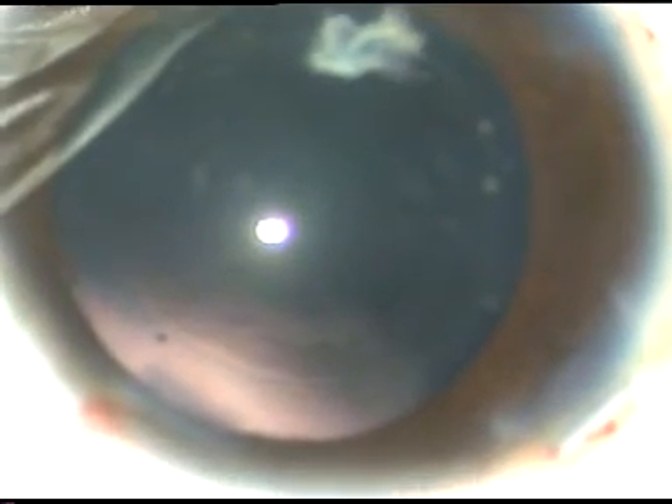A nice flap has been made. Now I hold this flap with Utrata forceps, go anti-clockwise, include this fibrous plaque, and a nice posterior capsulorrhexis has been made. I don't pull it out because then I will pull the vitreous strands through the main incision. So what I do is I introduce a cutter and remove this thick fibrous or calcified plaque.